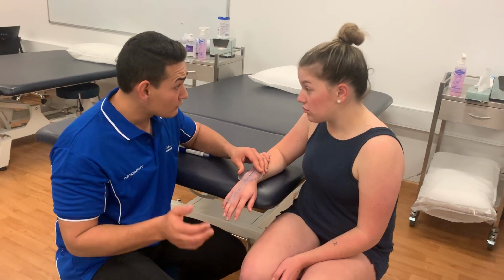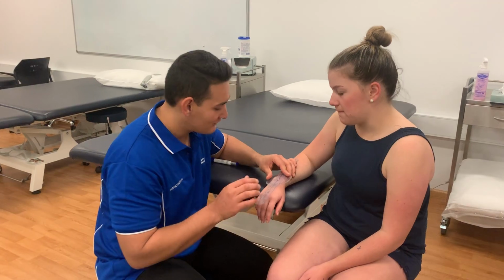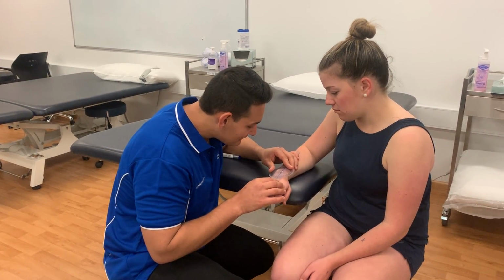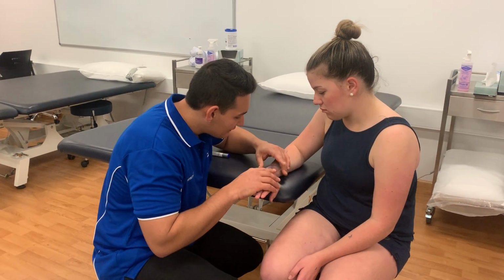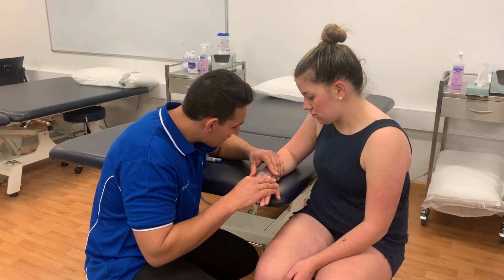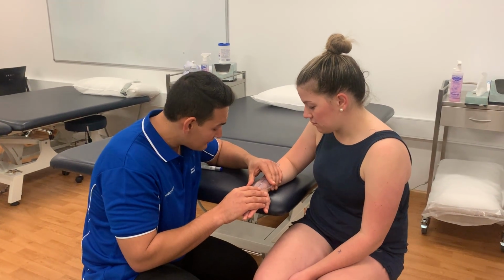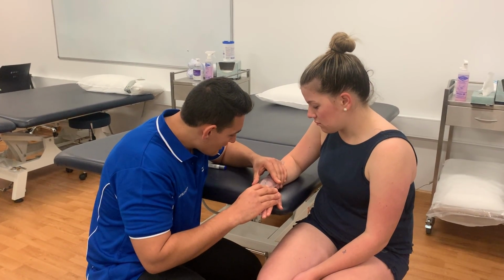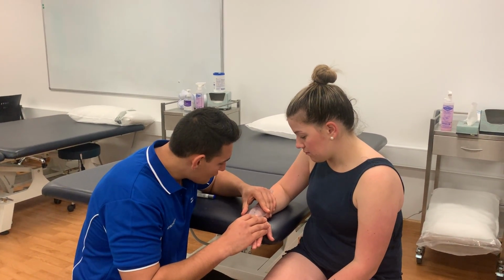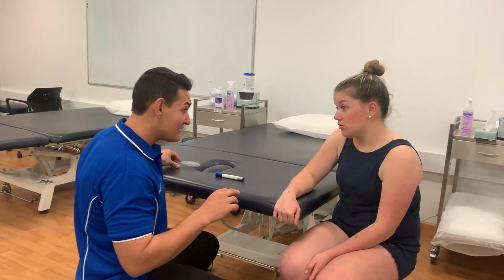With this side being your sore side, Simone, even in the smallest amount of pain, please let me know, because again, we don't want to cause any more pain in that wrist than we need to. Okay, in this one, we're going to move towards the thumb again and see what kind of value you get. I'm going to stabilize your radius and ulna. So if we just move in. Okay, so that's getting quite sore there now, around the 10-degree mark. If we could just get you to do that one more time. Okay, great. And just once more, is that okay? Yeah, that's fine. Okay. So that was about 10 degrees. So there is about a 10-degree difference there, Simone.